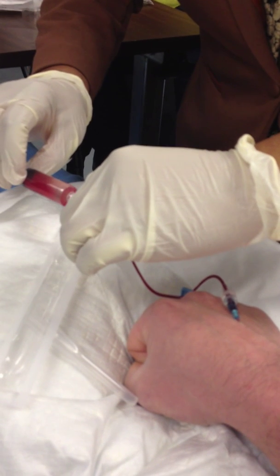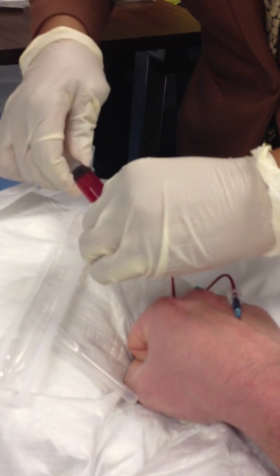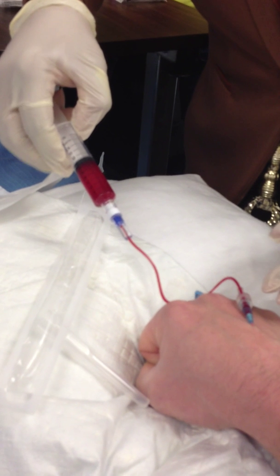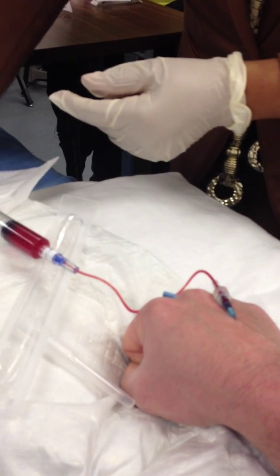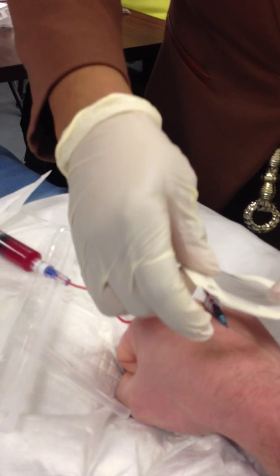Let's keep it sterile for you. And because I contaminated my blood, I'm going to go ahead and flush it a little bit because I don't want it to clot off. At this time, I'll go ahead and secure my IV with my transparent dressing here.